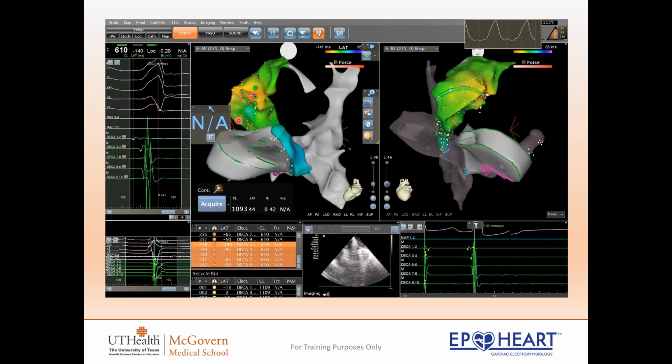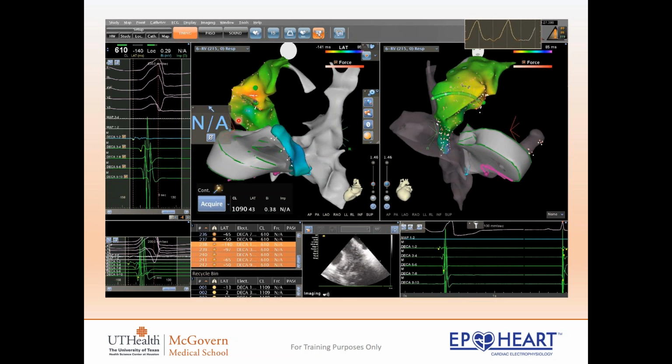Again, red is early, and early in EP is where we want to go because that's the spot that's causing the arrhythmia. At this point in time, they would take an ablation catheter and burn right at this spot. And when they burn there, that should terminate these PVCs because that tissue can't fire anymore.